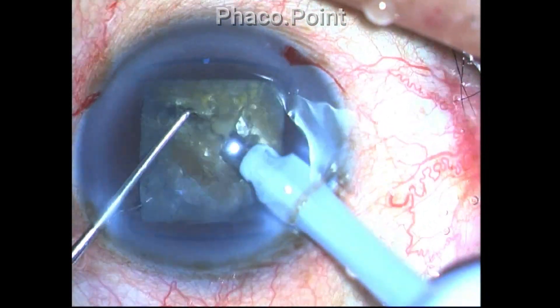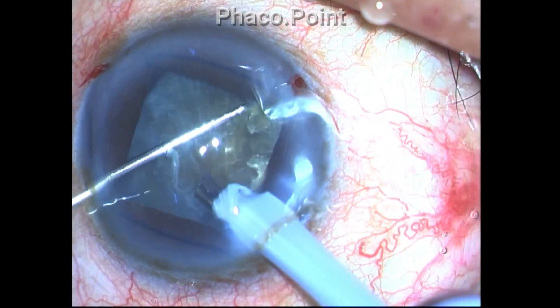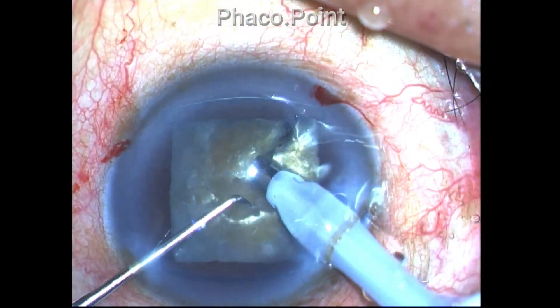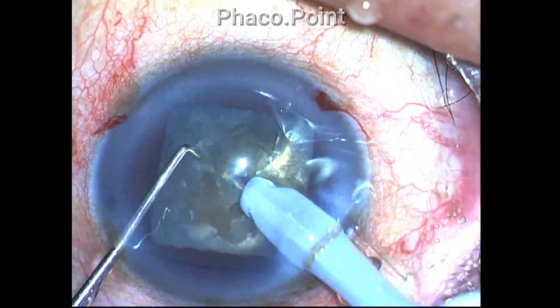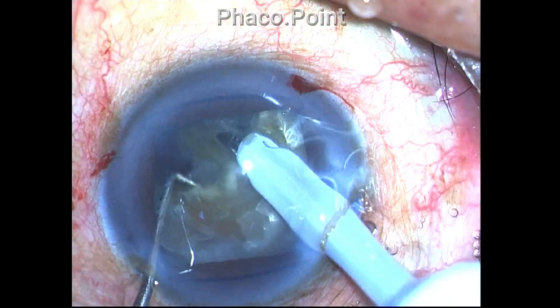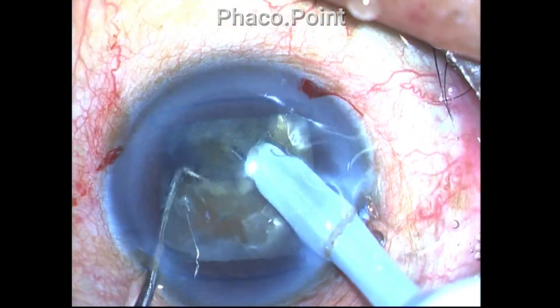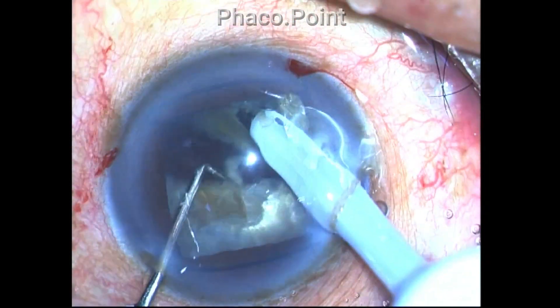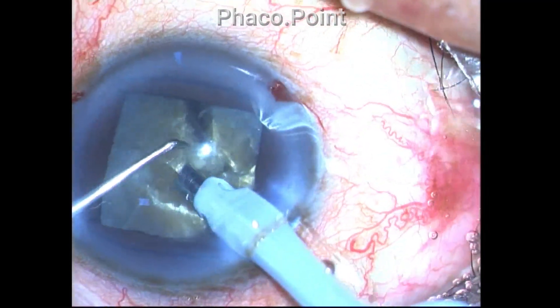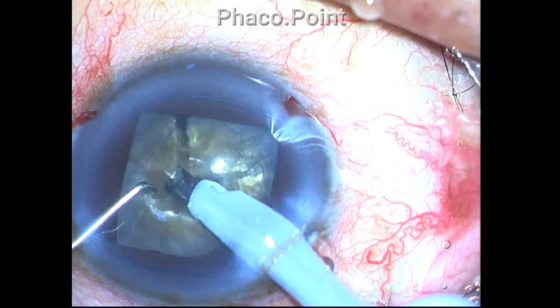The large mass of the nucleus and the shear forces that exist between the capsule and the large nuclear mass is the primary reason why rotation of these large nuclei is usually quite difficult. It's not that you have not performed a proper cortical cleavage hydrodissection.